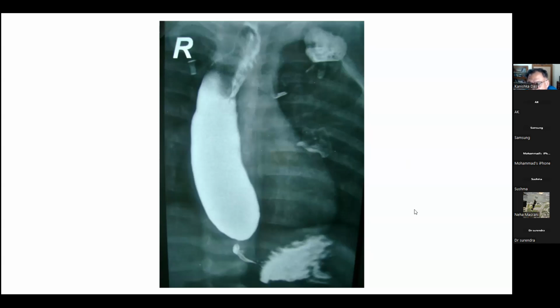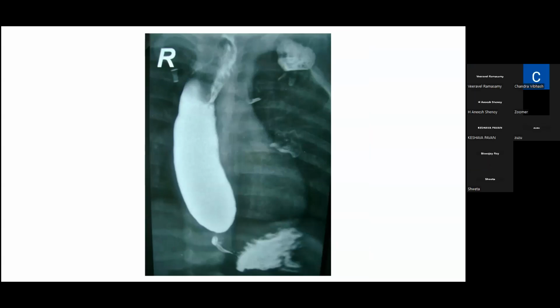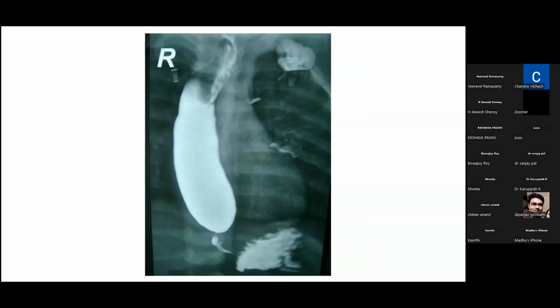This is a special dye study, sir, an X-ray dye study, a contrast study, taken in the AP position. We are not able to hear properly what you're saying. Come closer and speak loudly. The upper pouch, and the dye, there is a sudden cutoff with beaking, and then the contrast is going into.